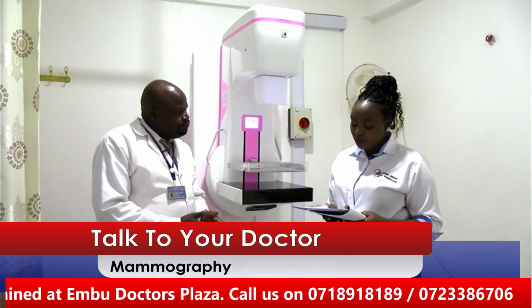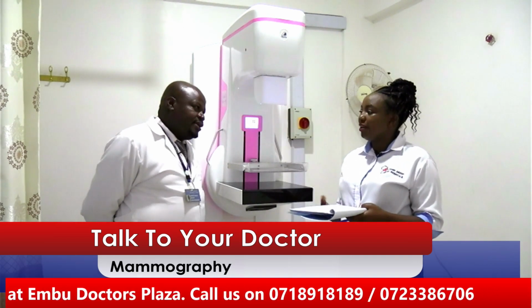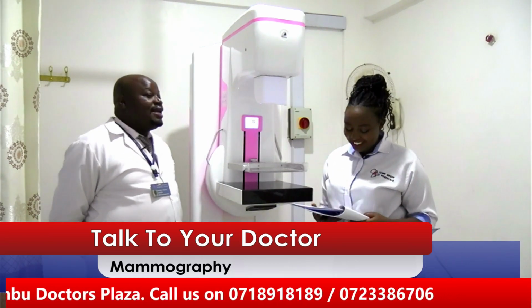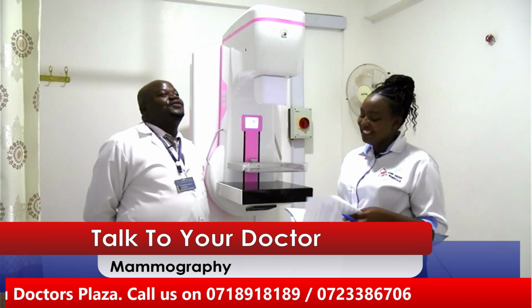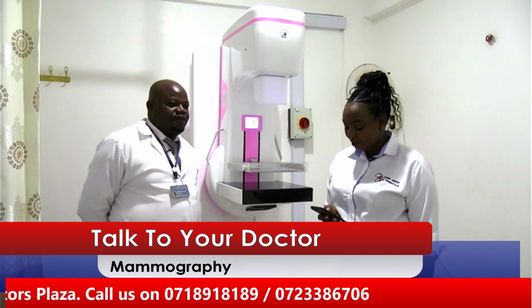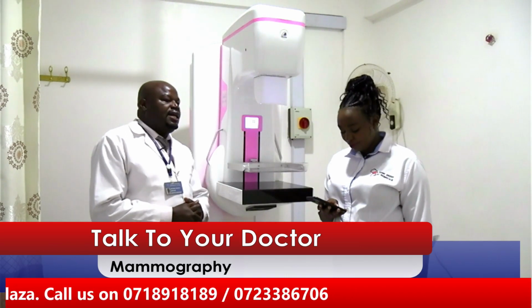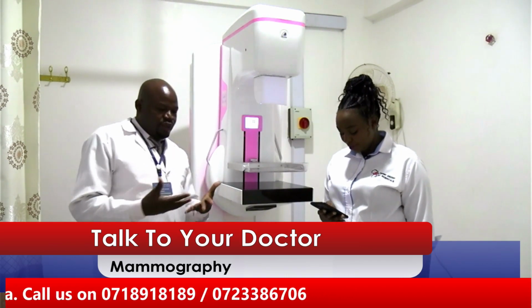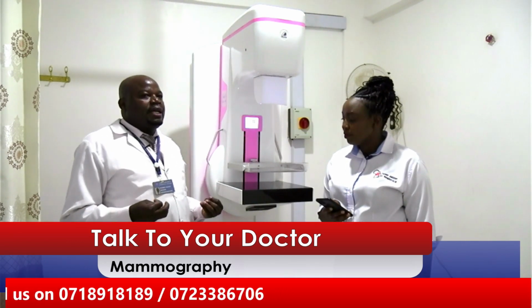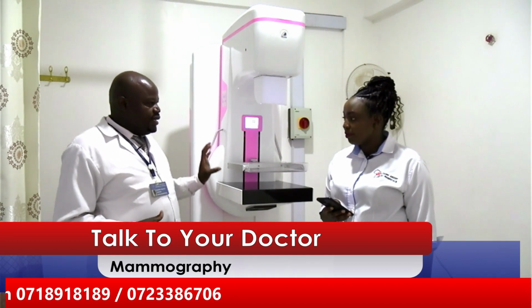Okay. So now we can maybe talk of the general limitations, not only for the pregnant mother. Number one, it's the one that we've talked about for the pregnant mother. Pregnant mothers, as I said before, are limited in performing the mammogram. And then for those people with breast implants, those breast implants will cause maybe the blurring of the images.